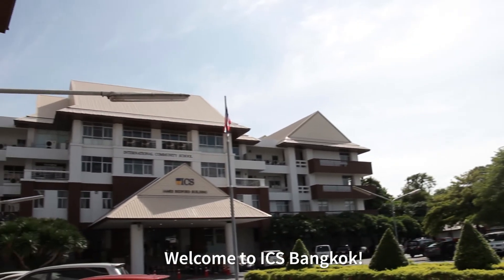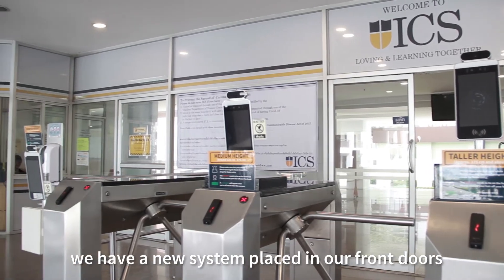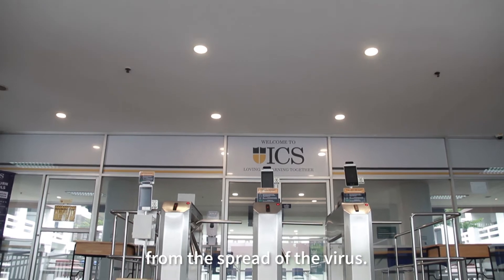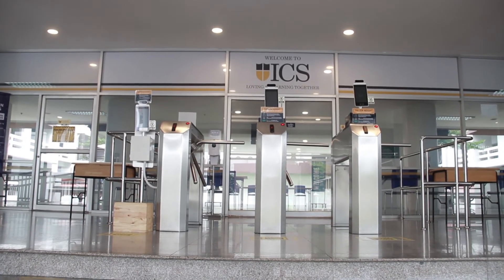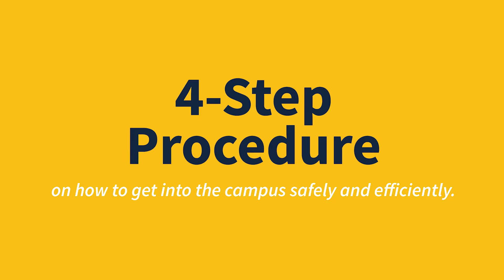Welcome to ICS Bangkok. As the school year starts, we have a new system placed in our front doors in order to protect our community from the spread of the virus. We will run you through the simple four-step procedure on how to get into the campus safely and efficiently.